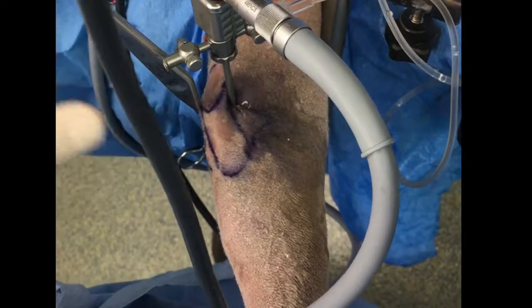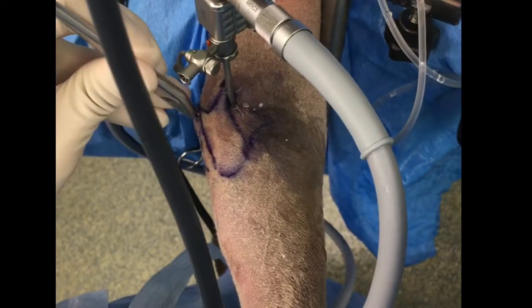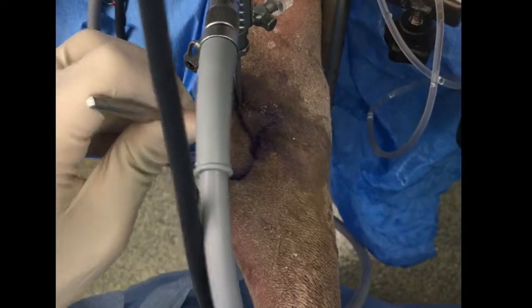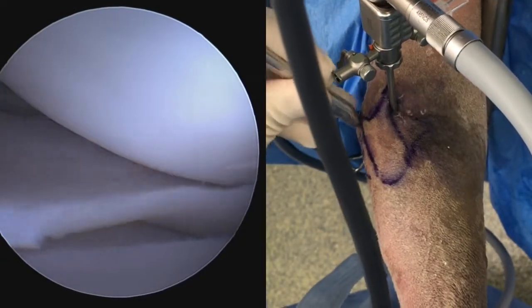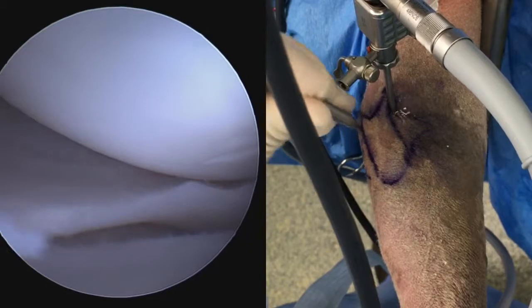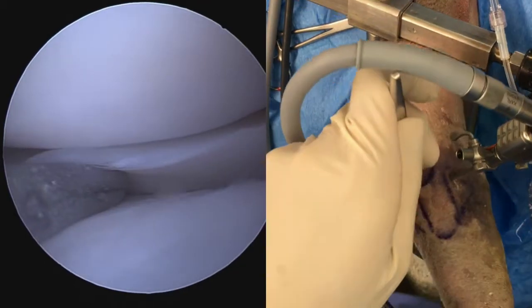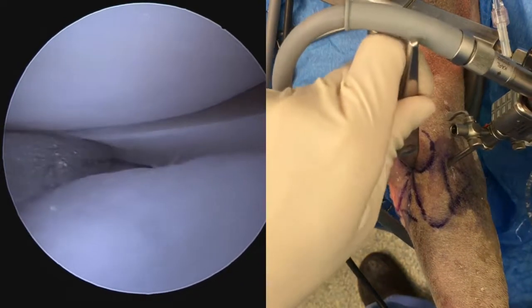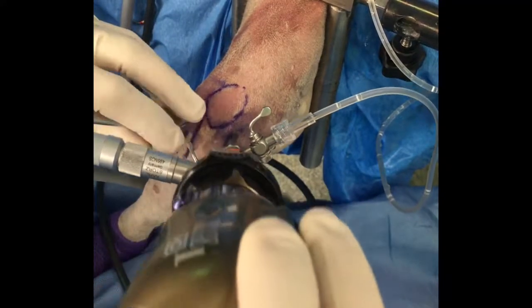Stifle arthroscopy in dogs is mainly used to assess the meniscus. Triangulating a probe into the medial compartment can be quite tricky — here we can see that the probe and the arthroscope are almost parallel to each other. We have the stifle fairly extended and levered into valgus. We need to interrogate both the tibial and femoral surfaces of the meniscus, and try to see if we can place the tip of the probe into a tear we might not be able to see. We also want to try to hook the caudal horn of the meniscus, pull towards us, and note any excessive mobility.